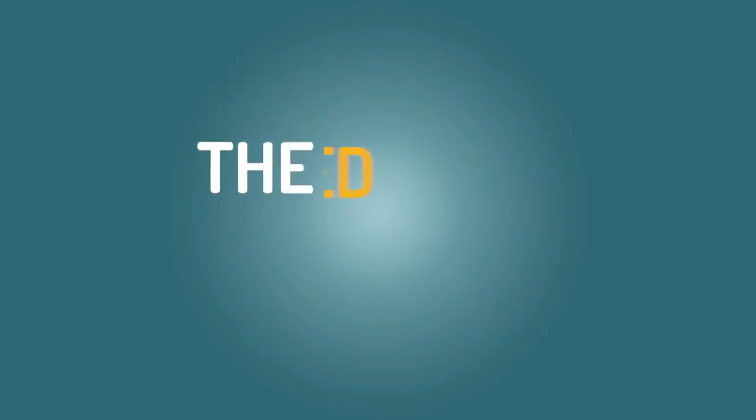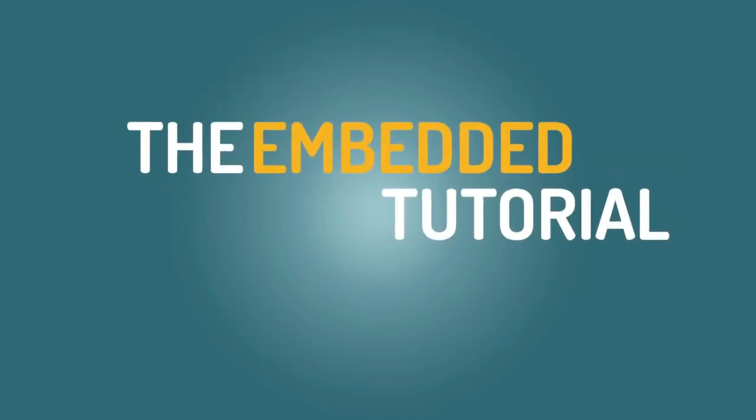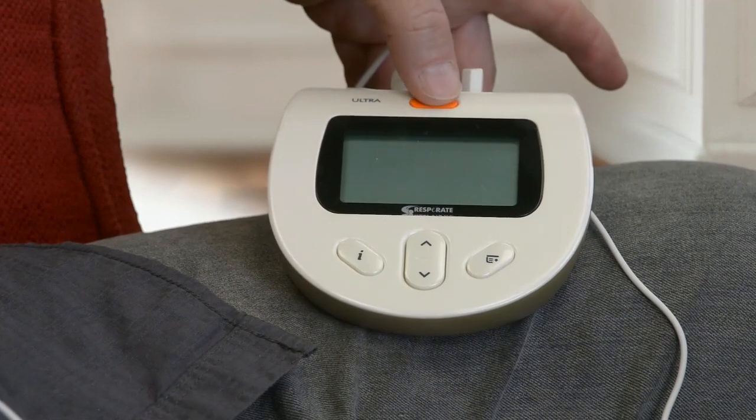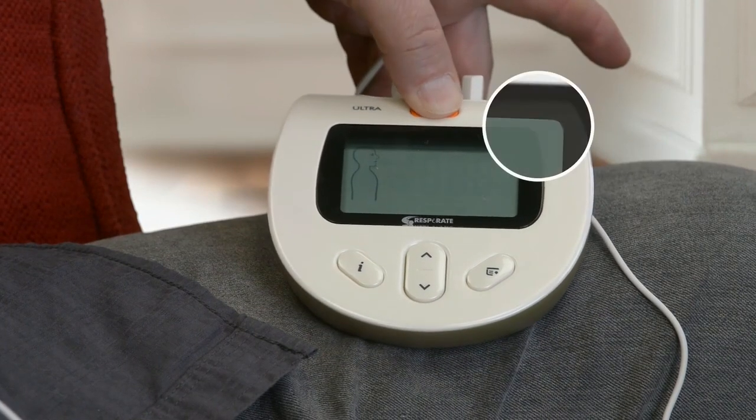With the sensor on your abdomen, now place the earbuds in your ears. Now you're ready to begin the embedded tutorial. Simply press and hold the on-off button until you see the question mark.